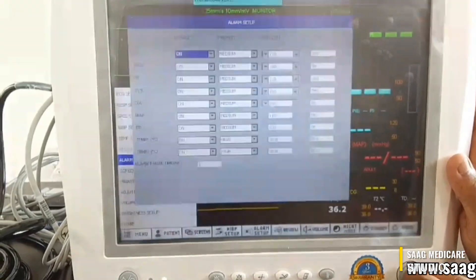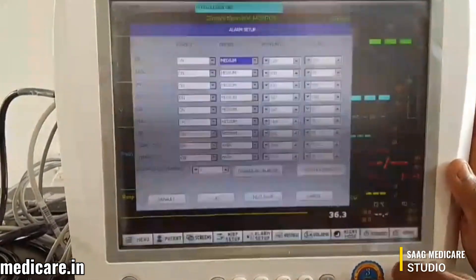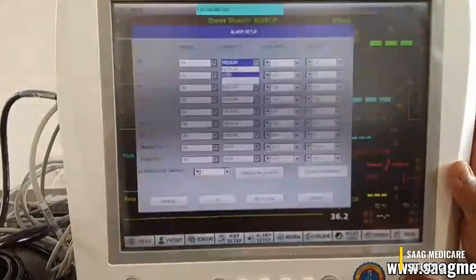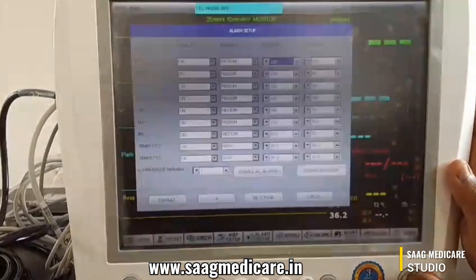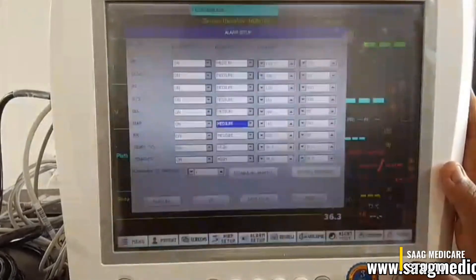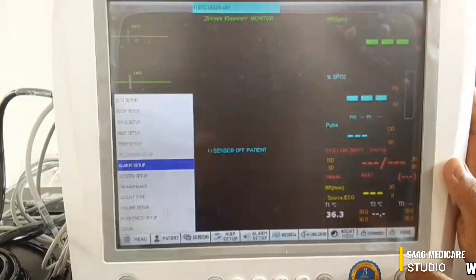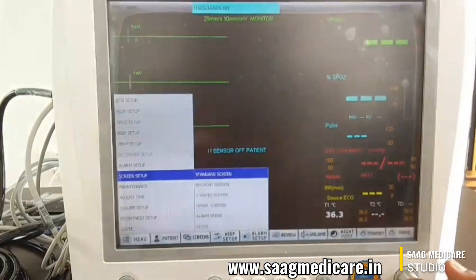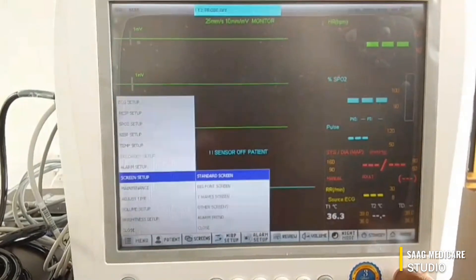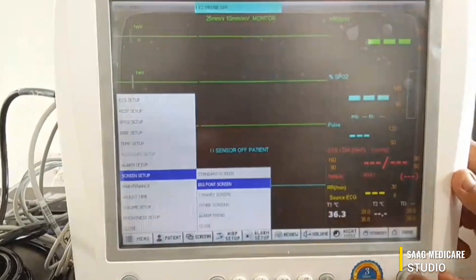In alarm setup, you can configure the heart rate alarm — you can turn it on and select medium, high, and set high limit and low limit. For all parameters like HR and SPO2, you can set the alarm levels. You can also see there are 7-waveform screen and big font screen options — if you want the big font screen, just select it.